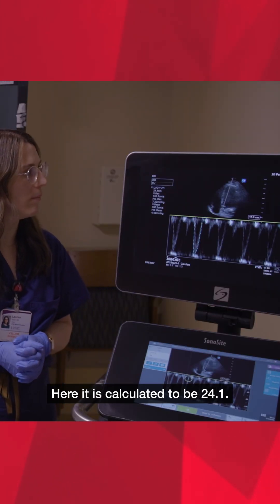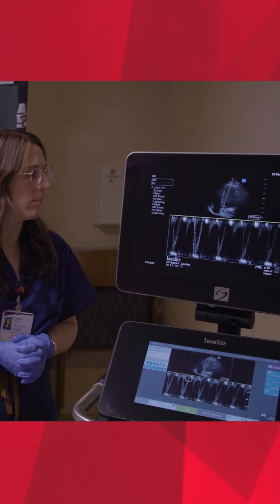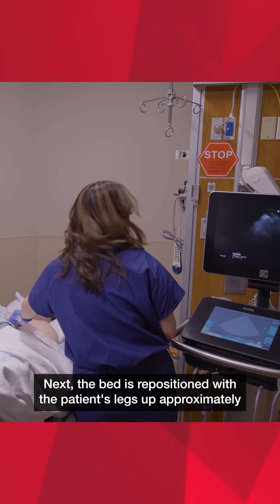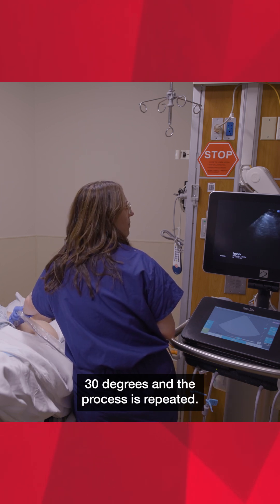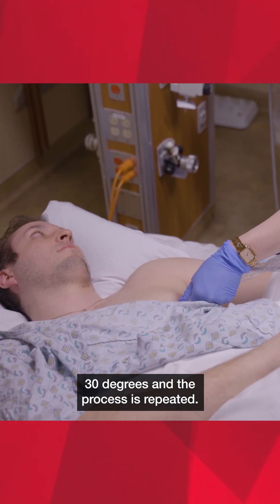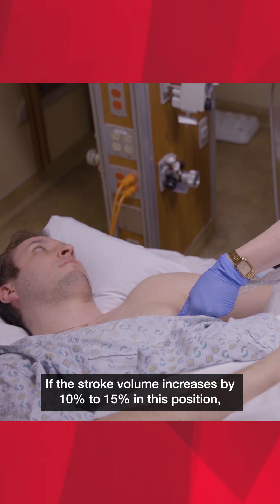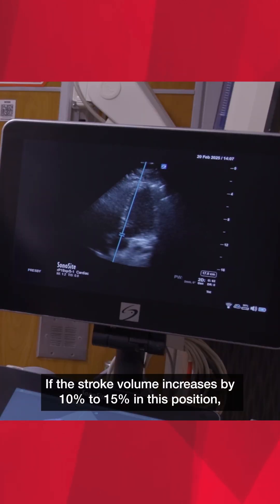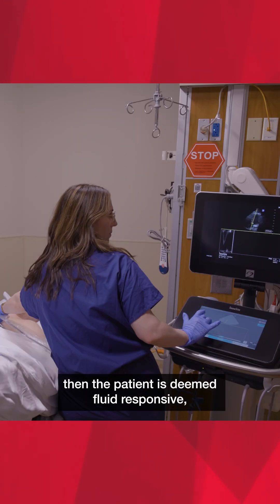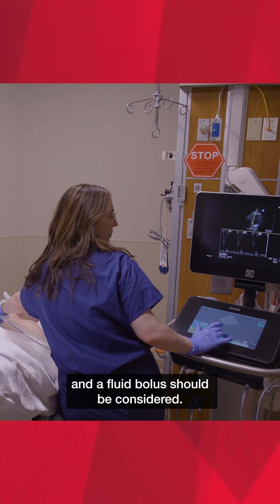Here, the LVOT-VTI is calculated to be 24.1. Next, the bed is repositioned with the patient's legs raised approximately 30 degrees, and the process is repeated. If the stroke volume increases by 10–15% in this position, the patient is deemed fluid responsive and a fluid bolus should be considered.